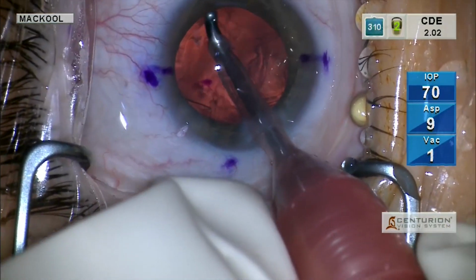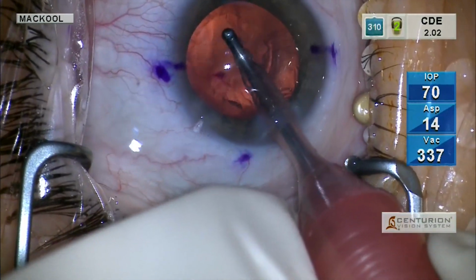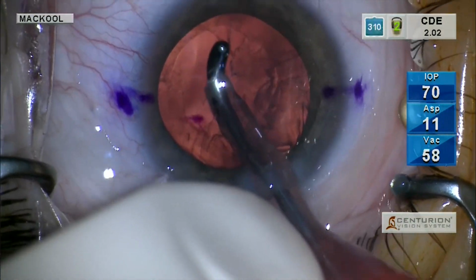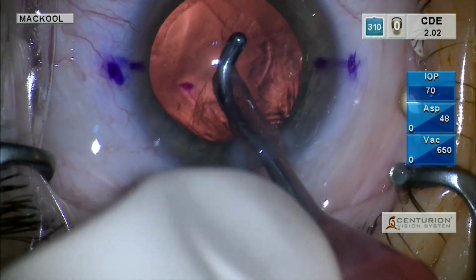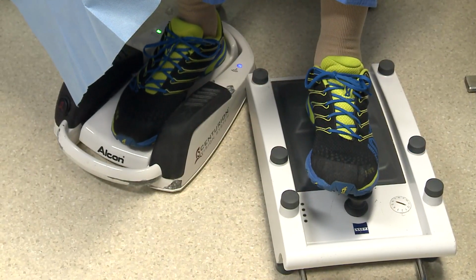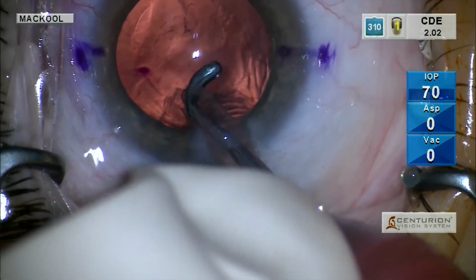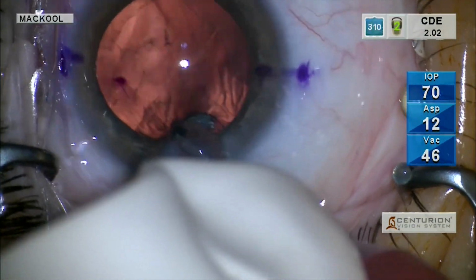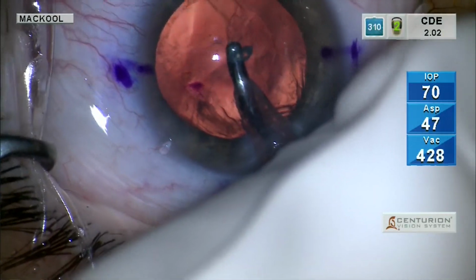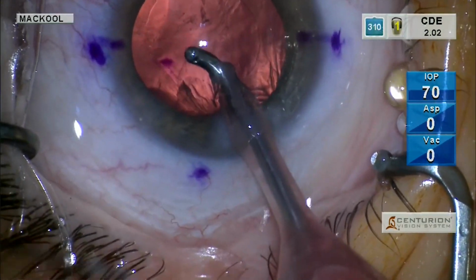There are many different I/A tips with different curvatures. Some of them are straight, some of them are 45 degree, but the principle is the same. Put the port against the cortex and then step on the pedal. That way you know what's going in the cortex.